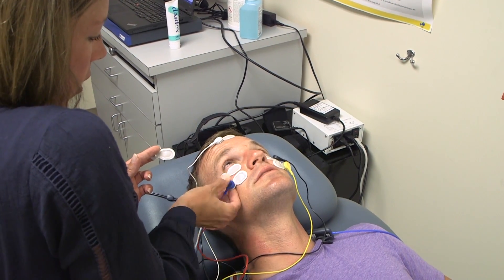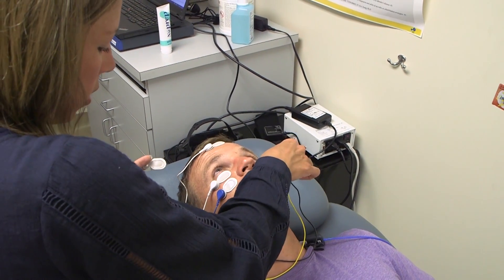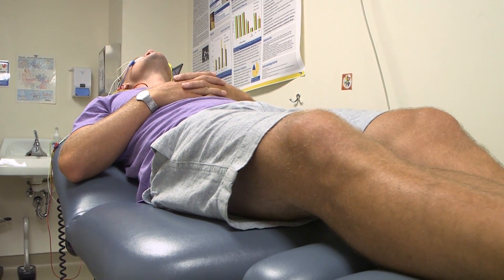When we measure the ocular VEMP, or the VEMP underneath the eyes, that's giving us information about the top branch of that nerve.